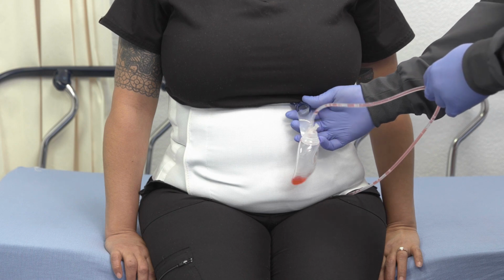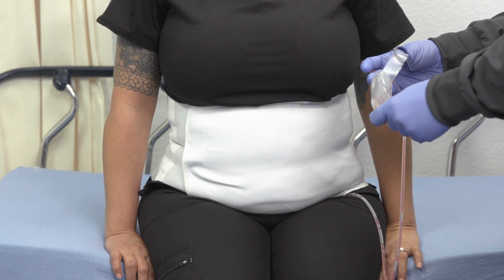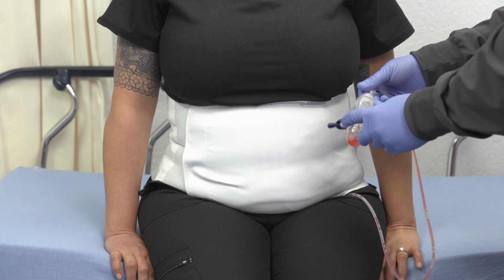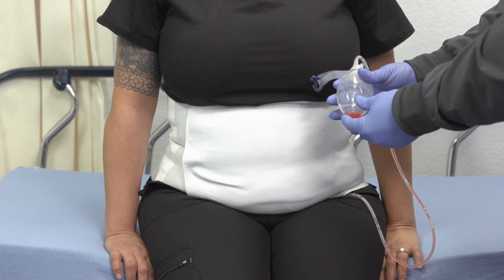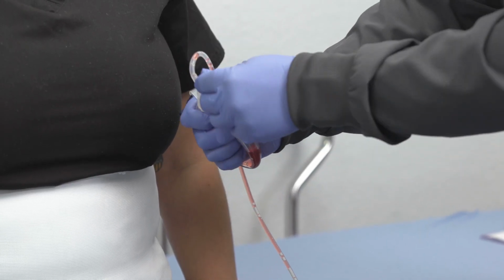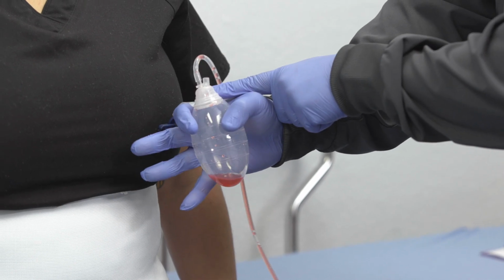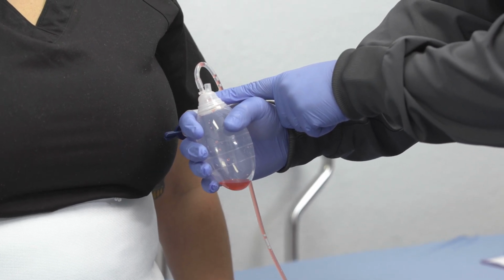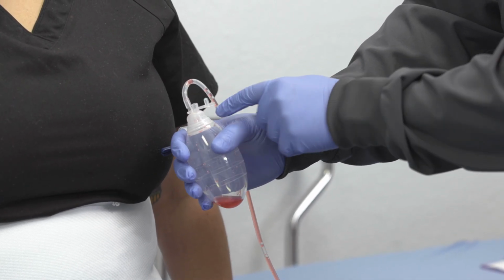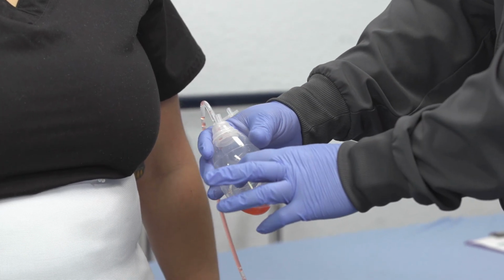The other issue you want to watch out for is if the bulb itself does not create that good suction seal. So if when you're done draining it and you have your bulb open and decompressed, you're gonna compress it, you're gonna cap it. If when you cap it, if you notice that the bulb just decompresses again, then that means you do not have a good seal in your drain. And there could be a leak somewhere in the tube, down at the insertion site, or in the bulb itself.